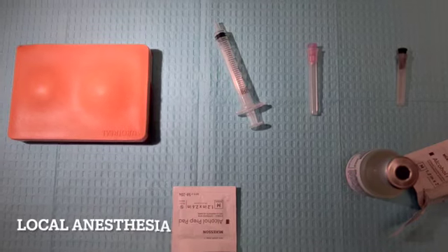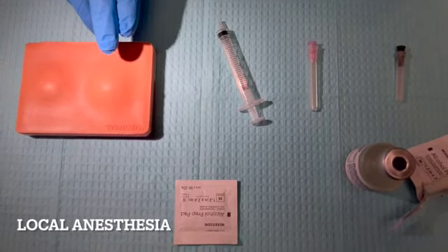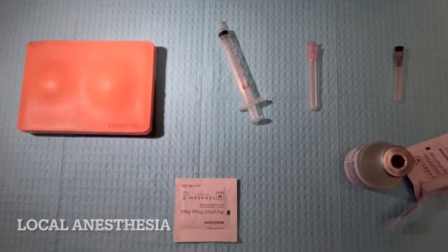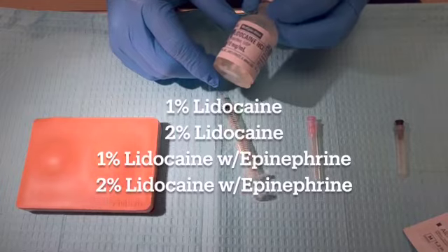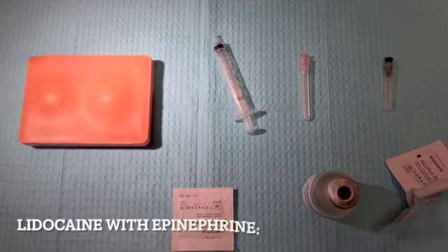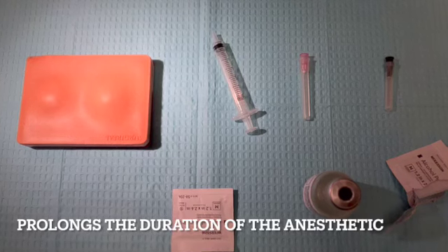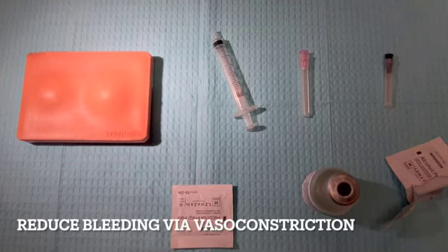Before we begin the procedure, we want to go ahead and perform local anesthesia in order to give the patient some level of comfort from this. In this instance, we'll be using 1% lidocaine. There's also 2% lidocaine. Another option would be lidocaine with epinephrine. Epinephrine typically will prolong the duration of the numbing agent and can reduce bleeding by producing local vasoconstriction.